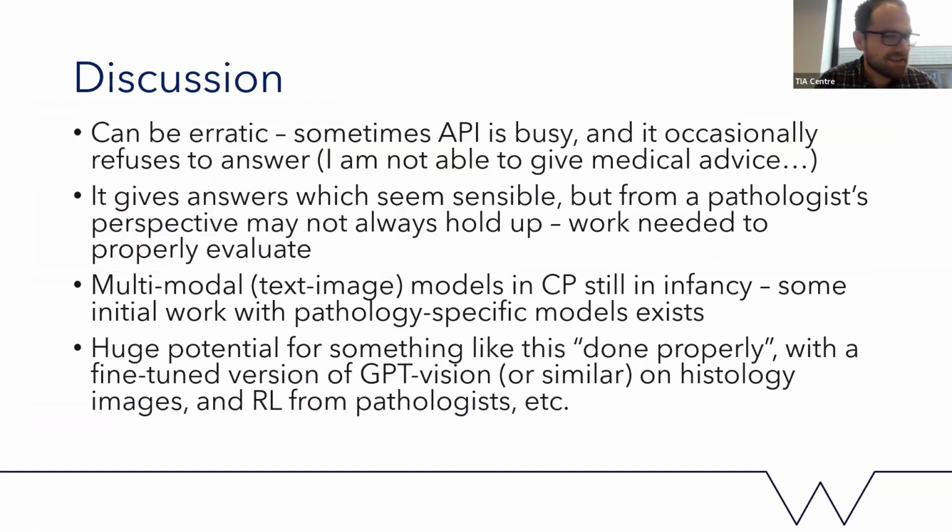So is that a question? Yeah, so that's really cool. So was it right, what it said? That's what I'm going to discuss a little bit here. It gives answers which often seem sensible, but there's not been a whole lot of work to properly evaluate how good ChatGPT Vision is at this. It's obviously not a specific model, so it's likely not to be amazing, and it does occasionally refuse to answer. It might say something like, I'm not able to give medical advice.